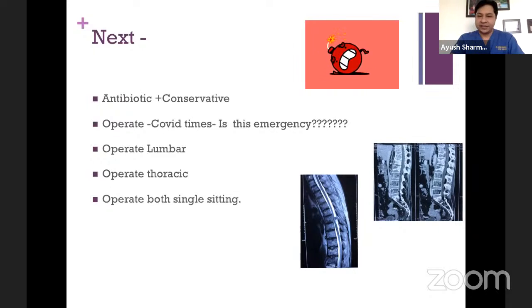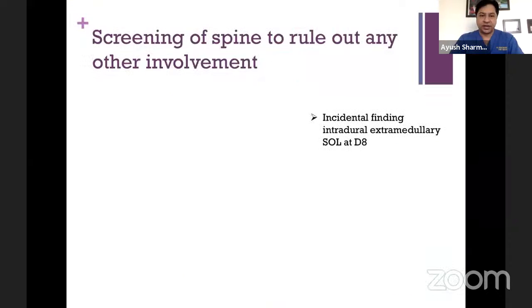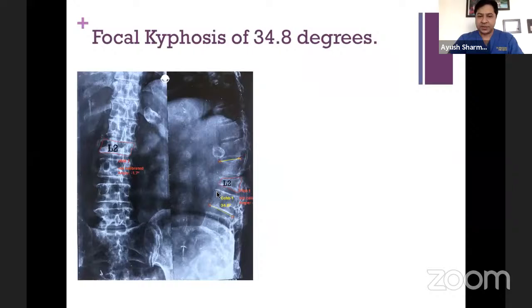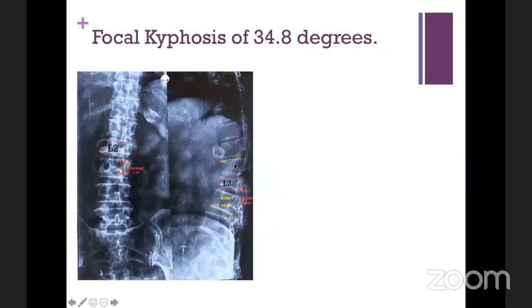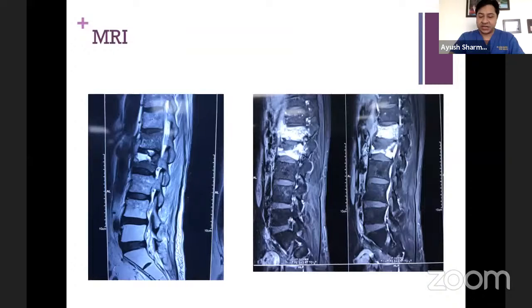So what we felt is that the pain is coming from the infection, and not only pain. If you look at the X-ray which we showed, she is definitely significantly kyphotic, so something has to be done at this level. And we felt the finding is just an incidental finding. That was our call. But there is extensive destruction happening here.